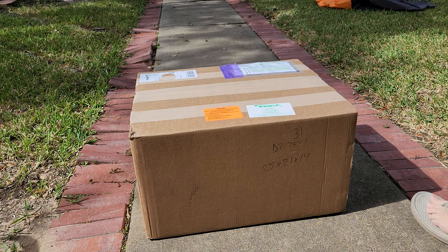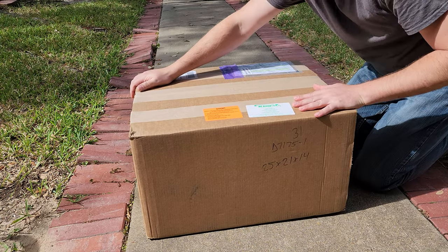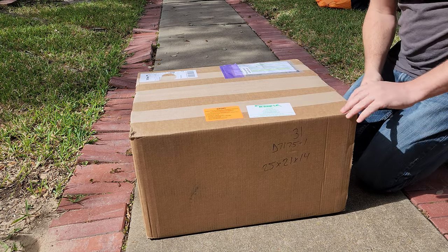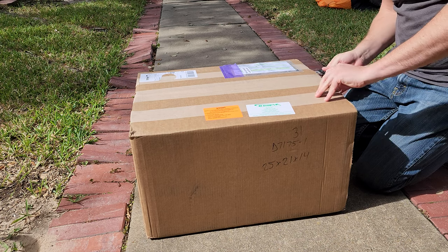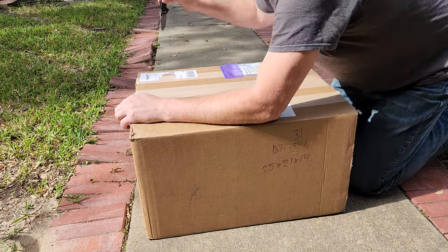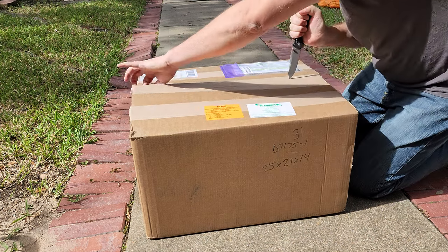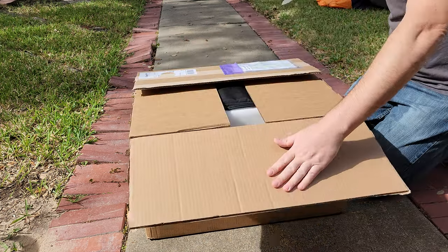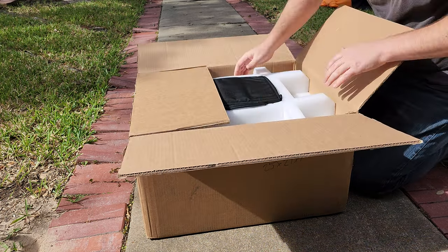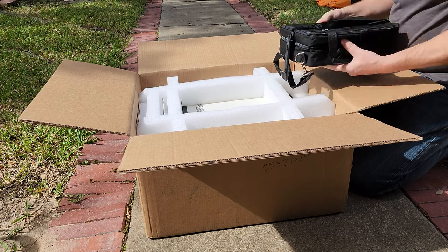Holy cow guys, look what just showed up to my house — it's a giant box from BC Group, and I am extremely excited. The only thing they're gonna be shipping me is some good stuff, that's a promise, and hopefully it's gonna be one of these new devices that the world has seen very little of. Oh wow, oh my gosh guys, I love new test equipment — this is beautiful.